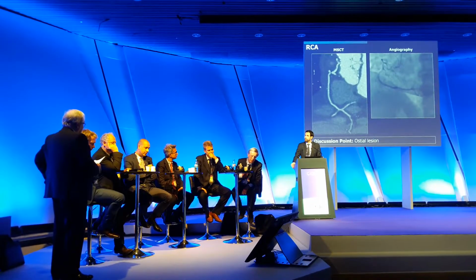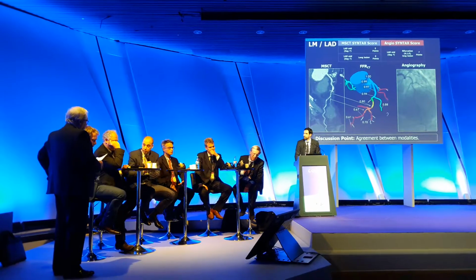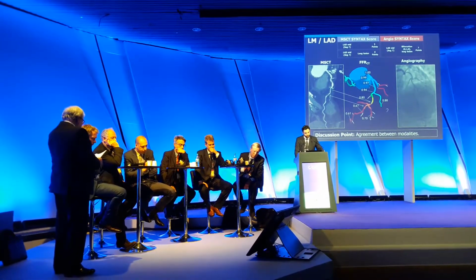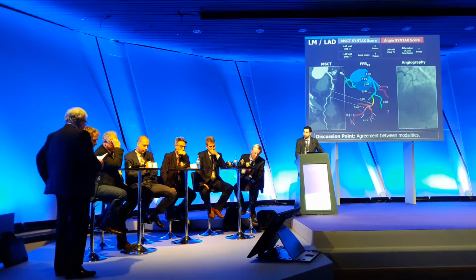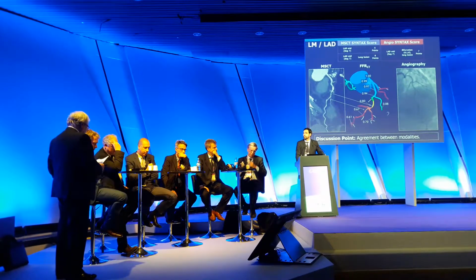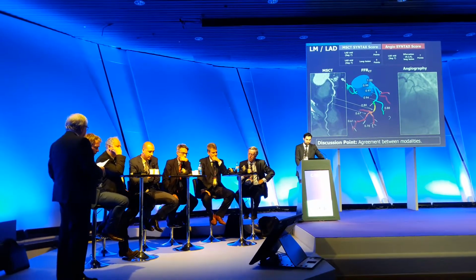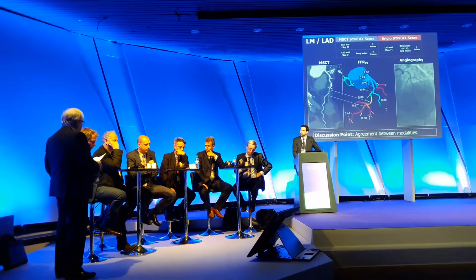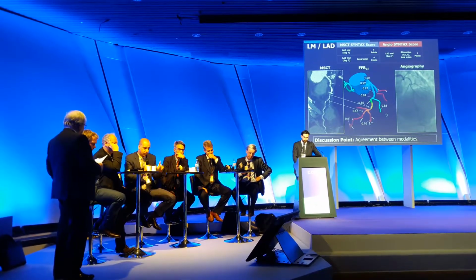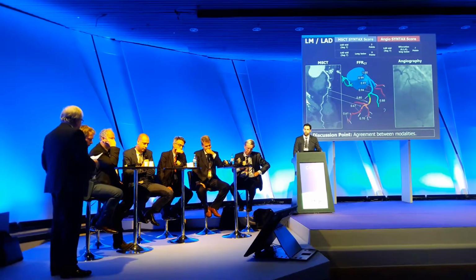In the LAD, it's more clear for us. It's a long lesion, starting probably already behind the diagonal branch and really extending up to the proximal part of the distal LAD. It's a very long disease. It's challenging to say where it starts, so once again I would use my FFR-CT up front and look point by point at the FFR measurements. But it's a long lesion with a beautiful landing zone for the surgeon.